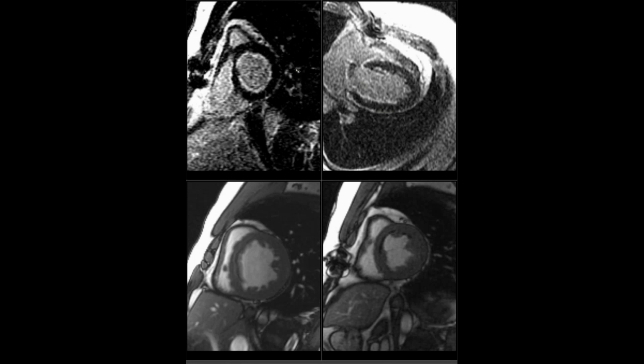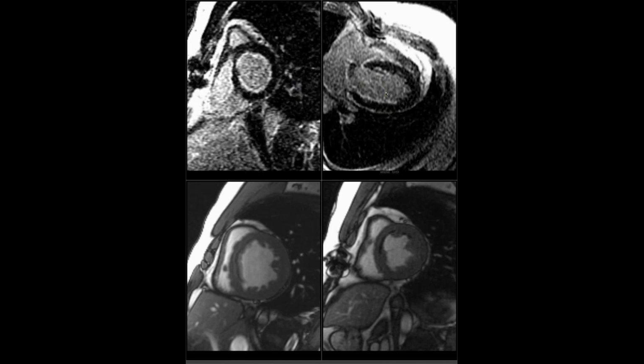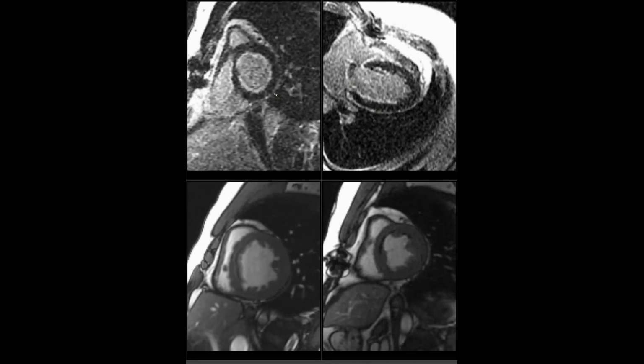Kid with a previous hypoplastic left heart repaired in infancy, now with subendocardial enhancement. I think David showed one with calcification. Travis had said that he saw some similar ones. I'm going to defer to Seth on this one. I think he may not have made it back.